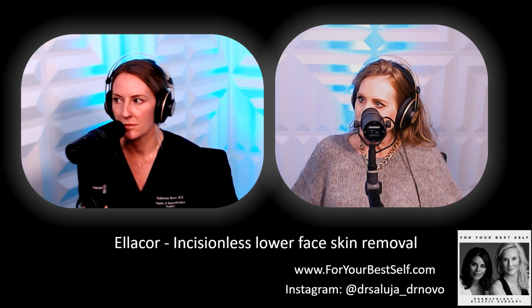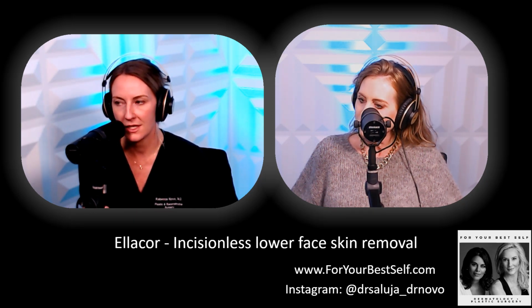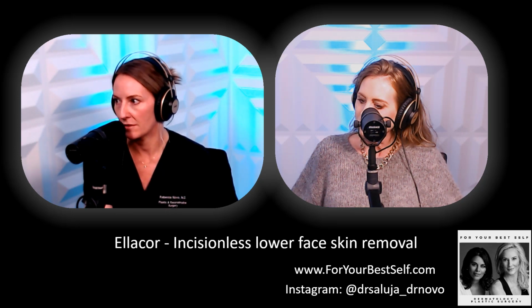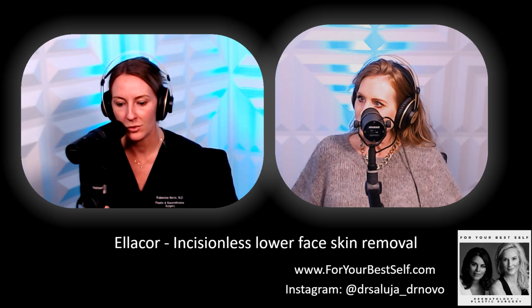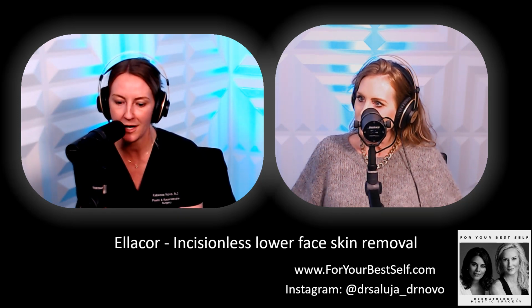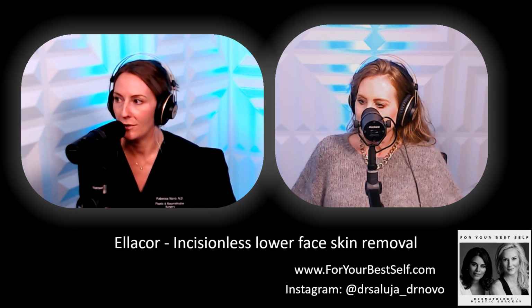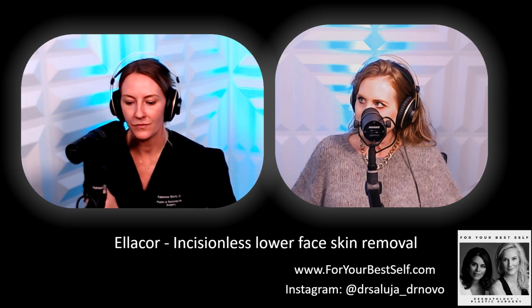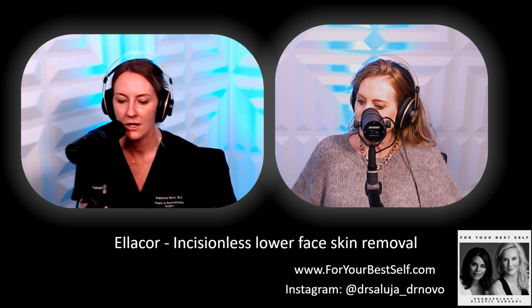And there are some skin disorders that we wouldn't treat, but really this is approved for skin types 1 through 4, so even darker skin tones, which a lot of procedures are not available to. We'll talk to you about the preparation, the pre and post care, which you'll hear is relatively simple. We'll do your photos and take a consent. And then it really boils down to the anesthesia and comfort measures. Because this is puncturing the skin, we want to make sure that you're comfortable.